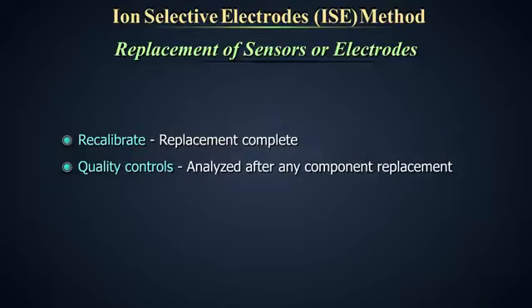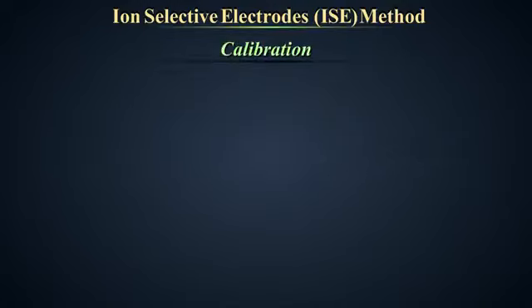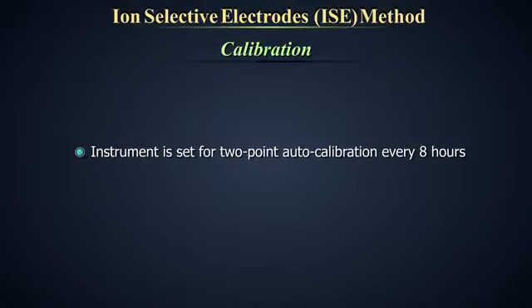Quality controls should be analyzed after any component replacement. Calibration. This instrument is set for 2-point auto calibration every 8 hours by the manufacturer. It may differ for machines from different manufacturers.